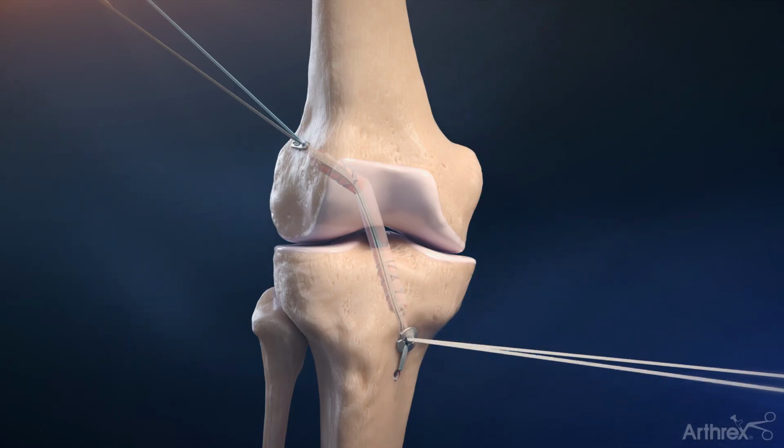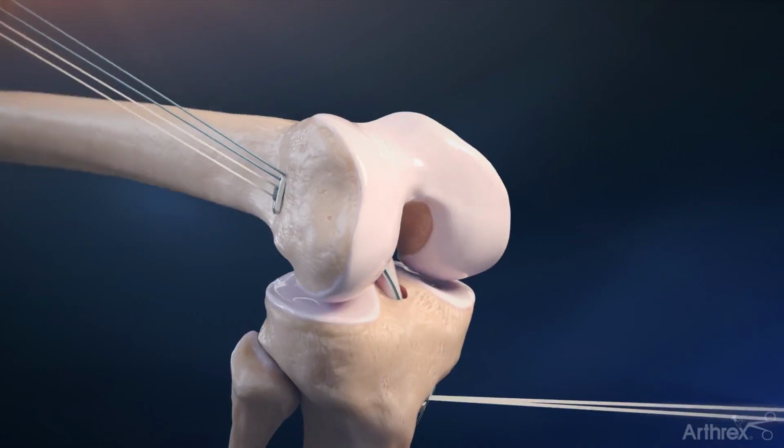Take the knee through range of motion and then perform final tensioning on the QuadLink construct.